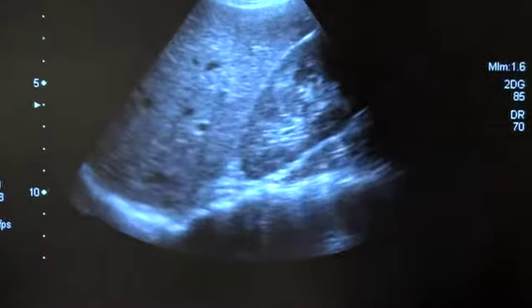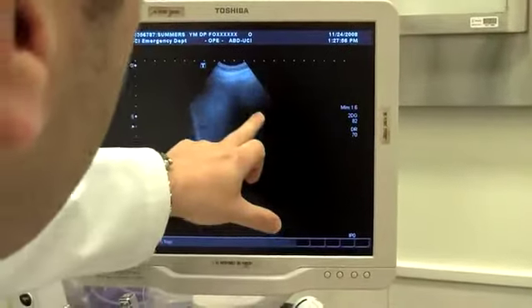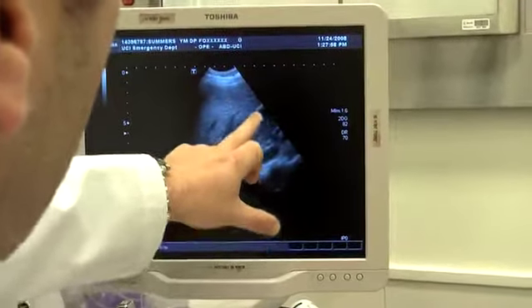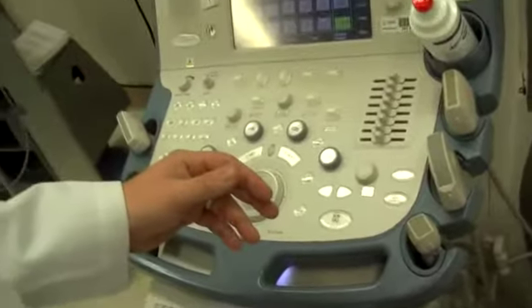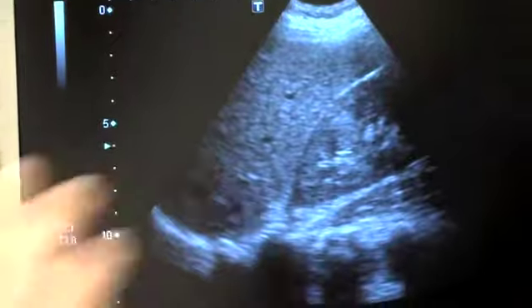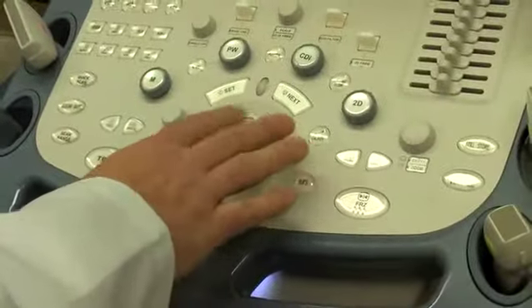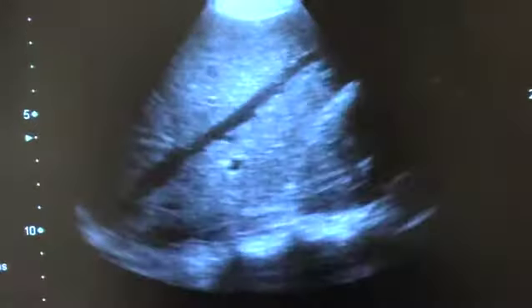When you're doing a FAST scan, you're looking for fluid in this pouch, Morrison's pouch, in the hepatorenal recess. Okay. So if I wanted to freeze this image to show my attending or show the trauma surgeon that it was negative, you could hit this freeze button right here, and it'll hold it. If you want to go back and, oh, I didn't get the right picture right there, you can go back with the trackball and it'll scan through the last 430 stills that you did while I was just scanning.